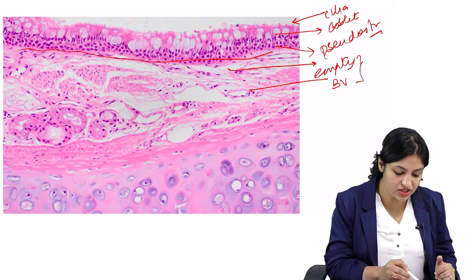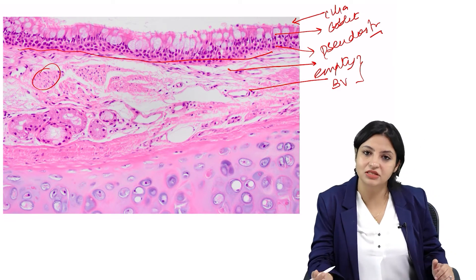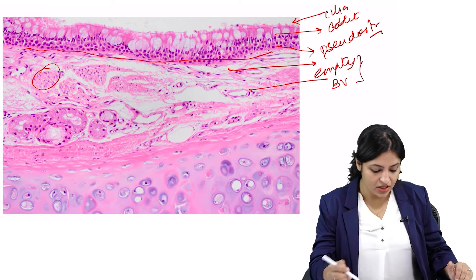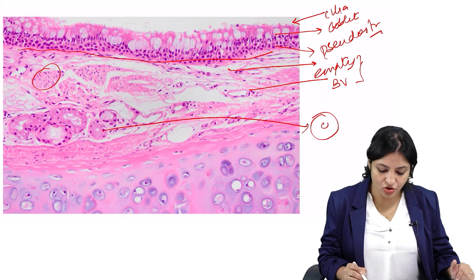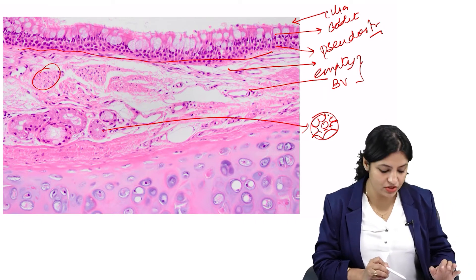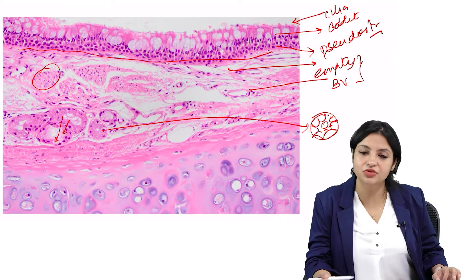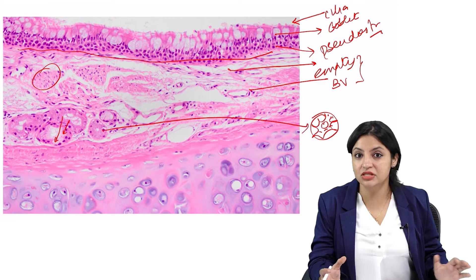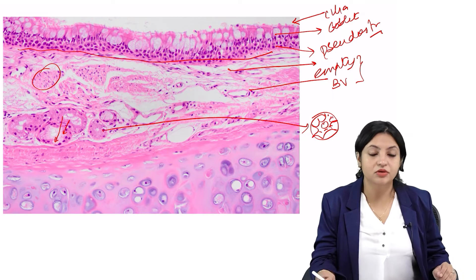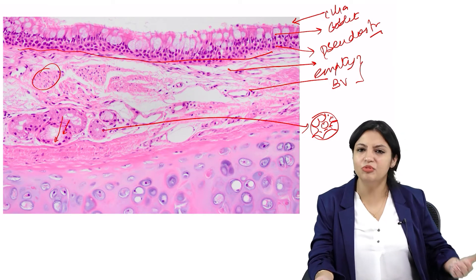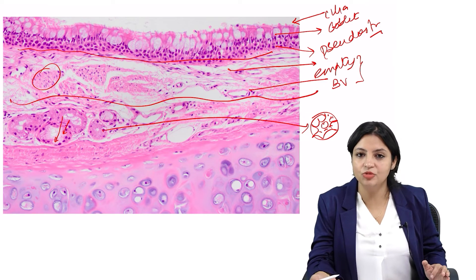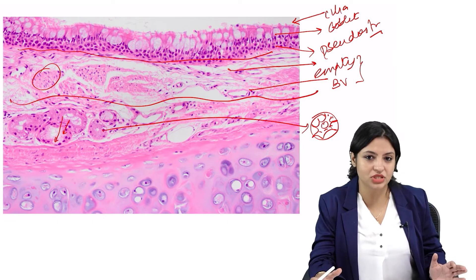Then you can see a cut section which is actually muscle — that's how muscle looks. So here we can see epithelium, lamina propria, and muscle, so the mucosa is complete. Now I'm seeing some glands here with a lumen filled with granules and vacuolated spaces — filled with mucus. These are seromucinous submucosal glands, present below the mucosa.